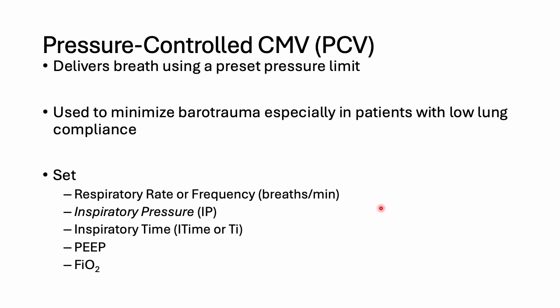So these three components determine the ventilation, or the minute ventilation: respiratory rate, pressure, and time.